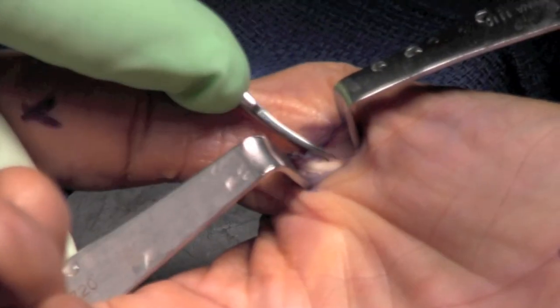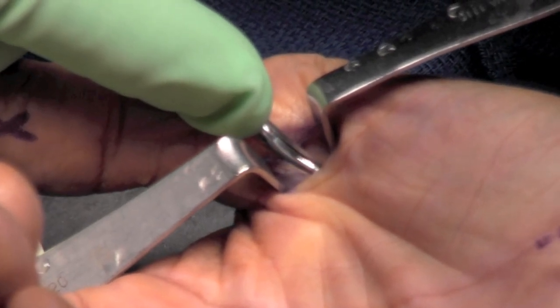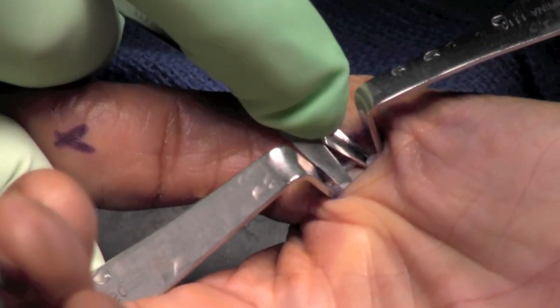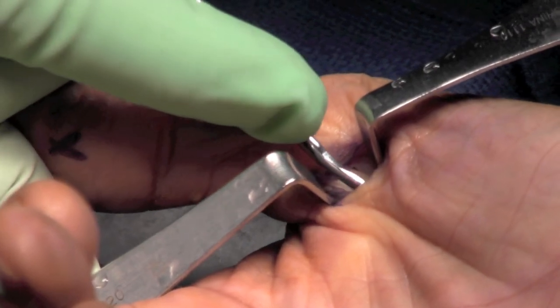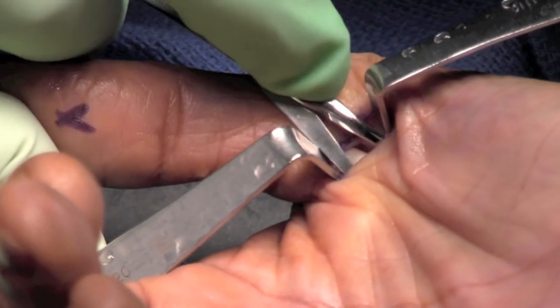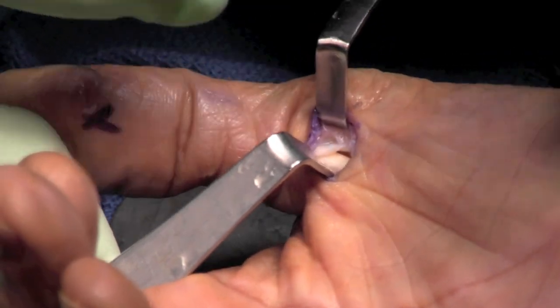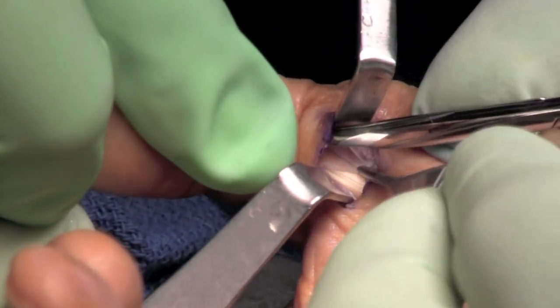Care is taken again not to injure the tendon or disrupt the neurovascular bundle. Proximally, the release is completed as well. The pulley leaflets are easily identified, and it is easy to note complete release because of the redundancy that is now in the leaflets.